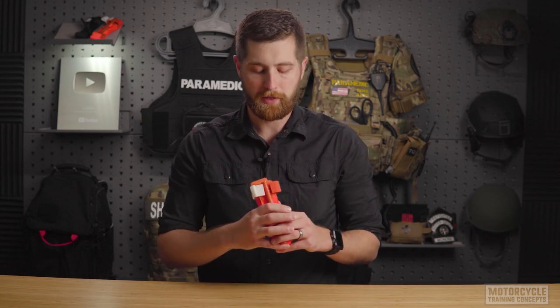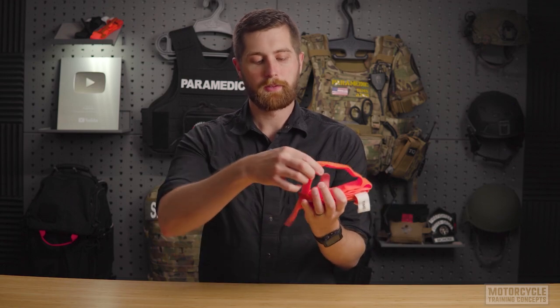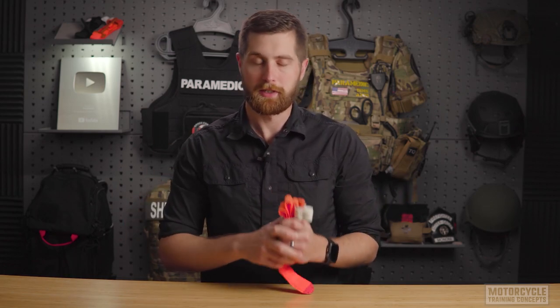The process for applying this to lower extremities in both buddy application and self-application is relatively the same. However, you may have to actually remove the end of the strap from the buckle to get it around a particularly large boot, or to apply it to a leg while the person is trapped under a piece of machinery such as a motorcycle.